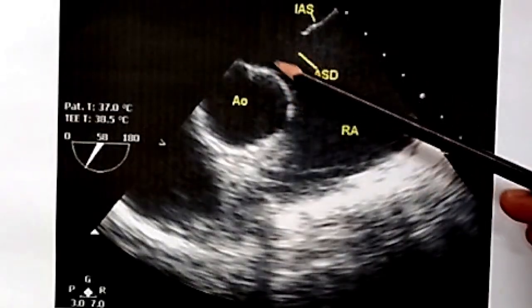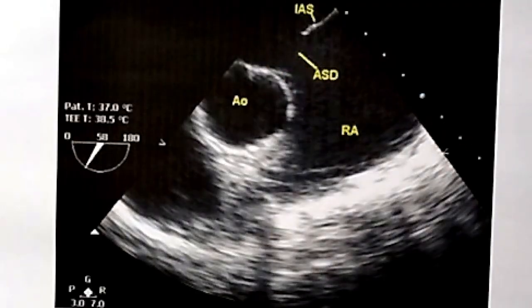Here you can see that the aortic rim is deficient, which is often the case. It may not be an absolute contraindication. We'll have to look at other rims which can hold the device in situ. If the device does not hold well, it can get embolized and require snaring or other procedure to retrieve the device which has embolized. So this is a transesophageal echocardiogram.